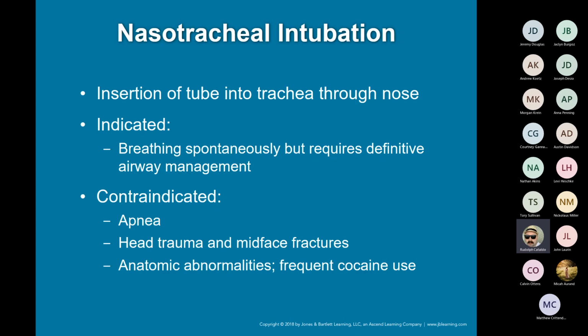Great. For us, we're probably going to end up dropping a different airway, such as a King or an i-gel or an LMA. But when it comes to totally apneic patients, those patients need to be orotracheal intubated. The only time I've ever truly seen a nasotracheal intubation is in the ICU. I can't remember what the reason was. Maybe the patient had their jaw wired or something like that, and they nasotracheal intubated the patient. It's also good for the simple fact that the patient can't bite down on the tube.